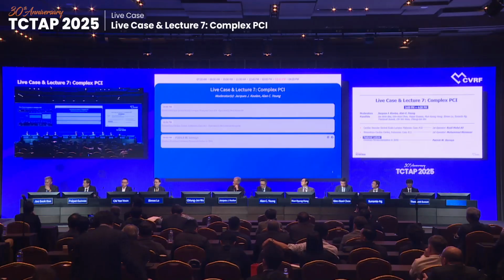You know, it's interesting that the surgeon, one of them is Torsten Dunst, doesn't speak anymore about revascularization. He's talking about cardioprotection for vulnerable plaque ruptures. And it's true that in this population of 114 patients that we have operated without conventional cine angiography, we have been looking at the presence of vulnerable plaque in the segment proximal to the anastomosis, distal to the anastomosis, and in the vessel that the surgeon did not treat.